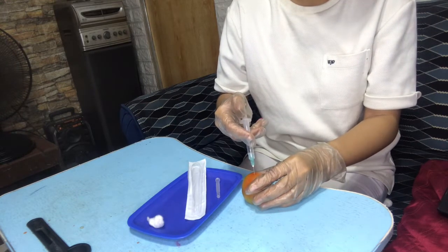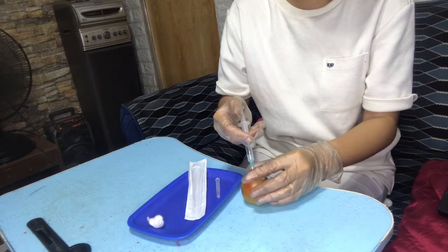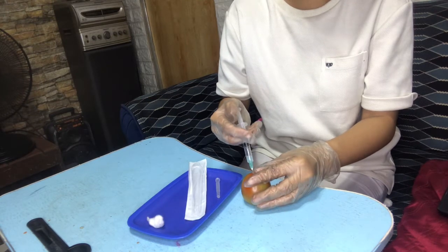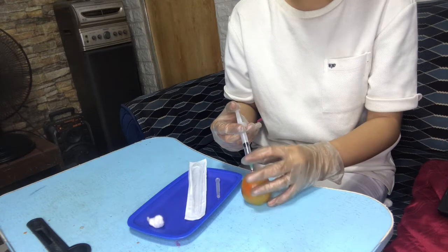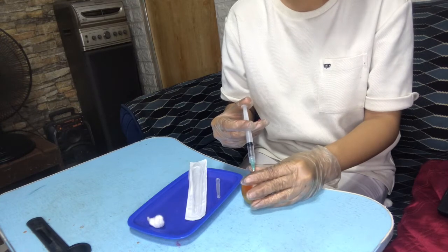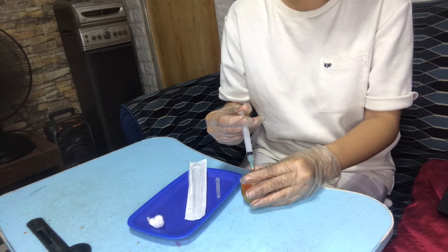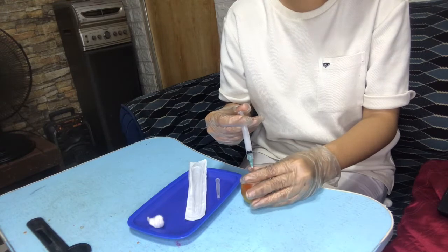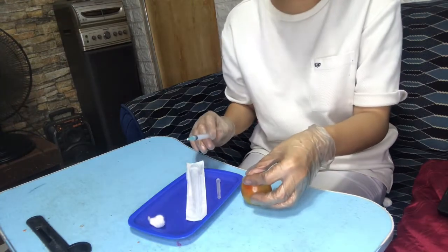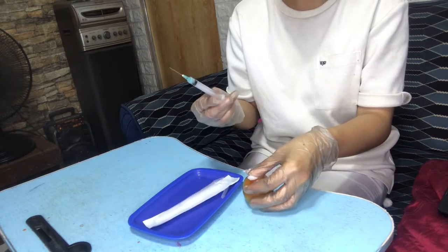Next, when the needle is inserted, move your non-dominant hand to the end of the plunger. Some nurses find it easier to move the non-dominant hand to the barrel of the syringe and the dominant hand to the plunger. Inject the medication by holding the syringe steady and depressing the plunger with slow, even pressure. Next, remove the needle smoothly, pulling along the line of insertion while depressing the skin with your non-dominant hand. If bleeding occurs, apply pressure to the site with dry, sterile gauze until it stops. Discard the needle.